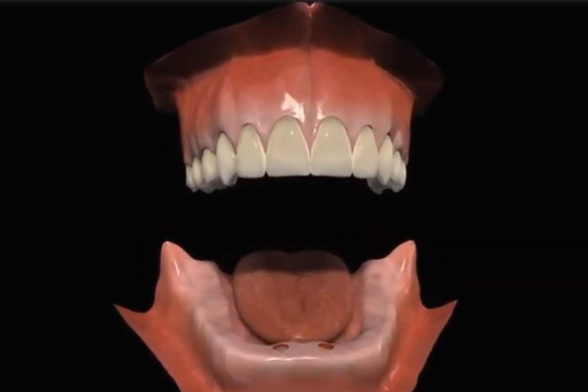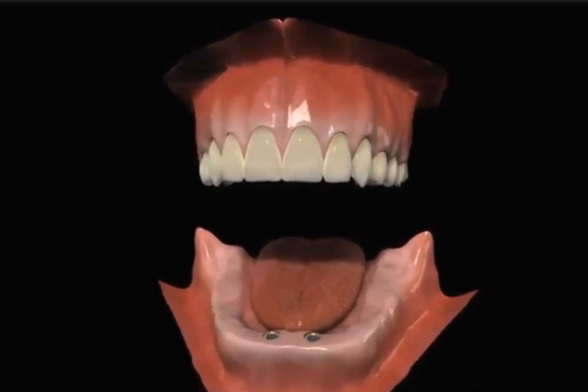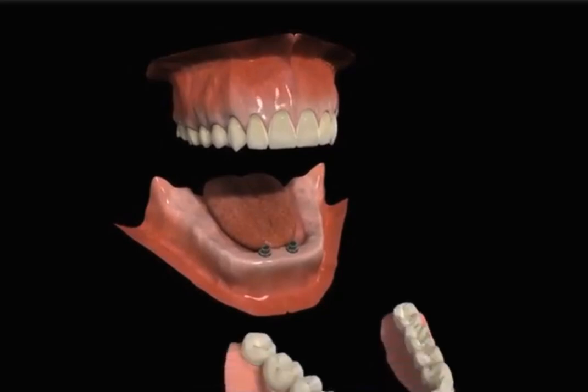If you wear dentures, you already know that over time your jawbone shrinks, making your denture loose and difficult to wear. In this situation, two implants can be placed into the jawbone.